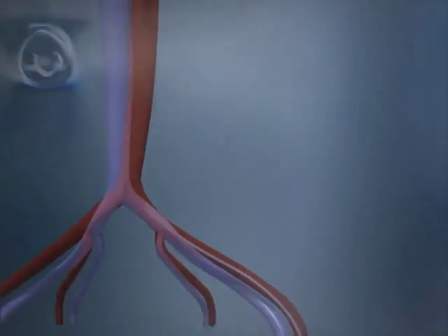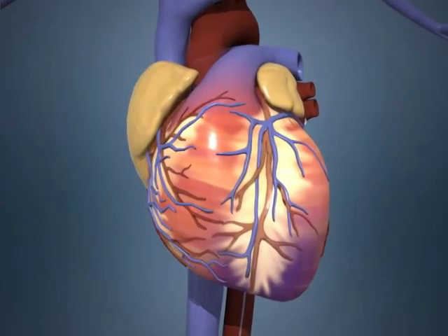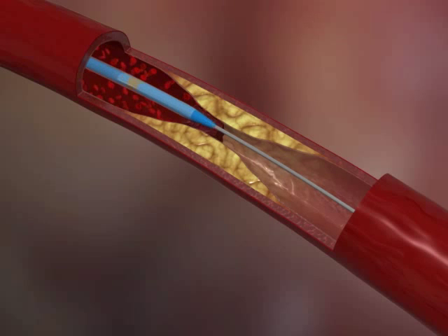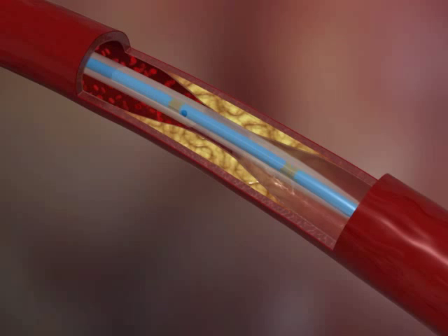The use of the Amicath is indicated in cases of primary angioplasty when the flow of the responsible artery is TIMI 0 to 1. After the guide passes the occlusion, the catheter is inserted past the 4th radiopaque marker. This makes it possible to rechannel the artery by means of the Dotter effect thanks to the conical shape of the Amicath, providing access to circulation distal to the occlusion through the perfusion holes.